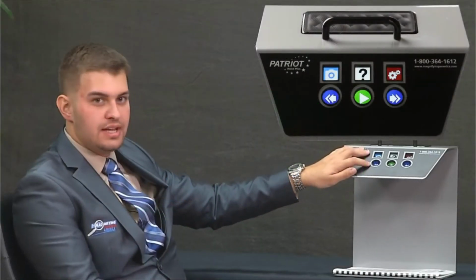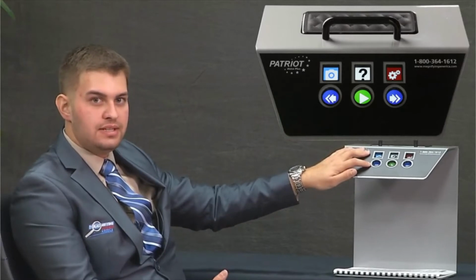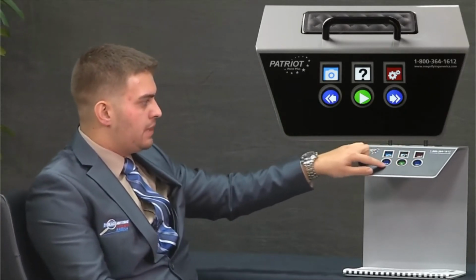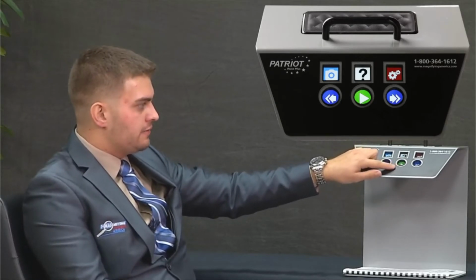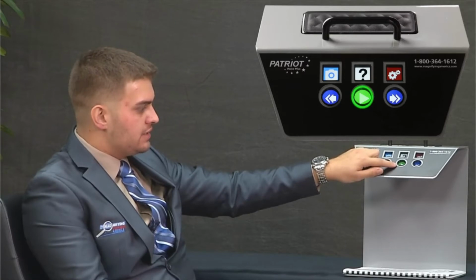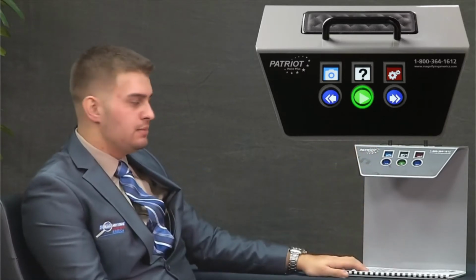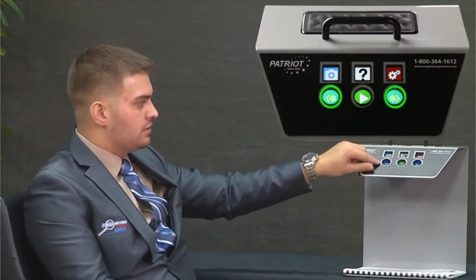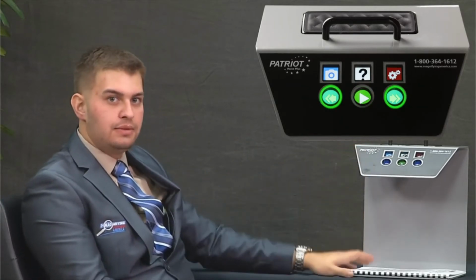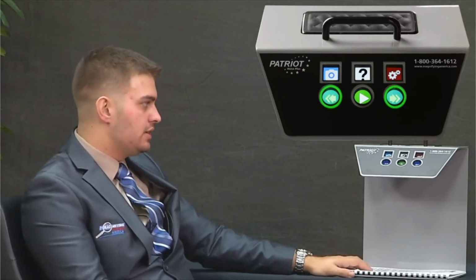The illumination does help if you're in a dark setting to be able to see the buttons a little bit easier. There's 3 per row, and the bottom 3 are the 3 that I'm going to go over first. The bottom middle one is to pause and play the machine, so that's the one that I just pressed to pause the document. The left and right arrows to the left and right of that are to skip forward or backward a sentence at a time of the document, so that's your navigation.